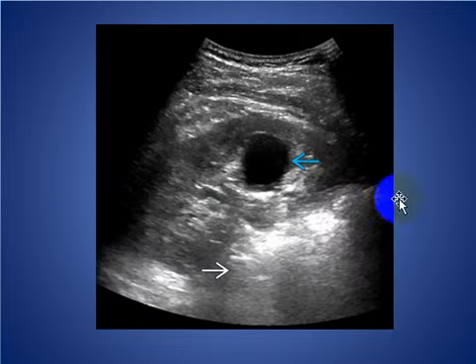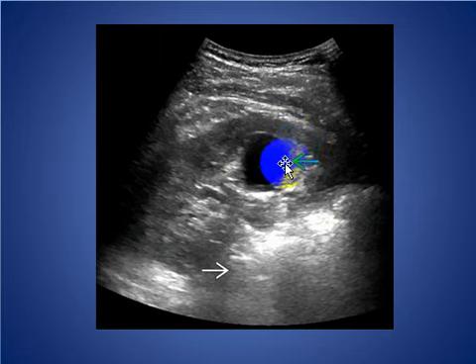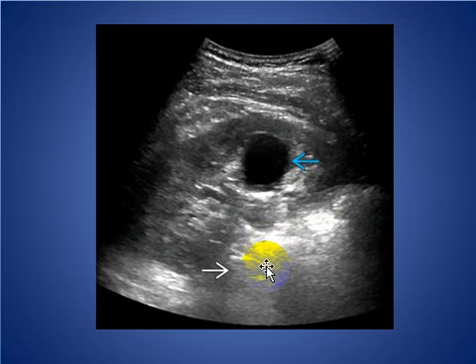This is an ultrasound, long axis of the kidney. We see a hypoechoic mass lesion in the mid-lateral kidney with acoustic enhancement, indicating that it is cystic in nature.